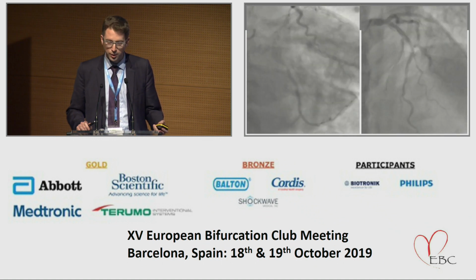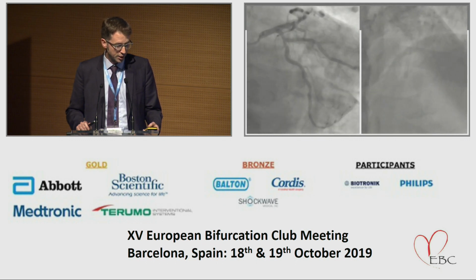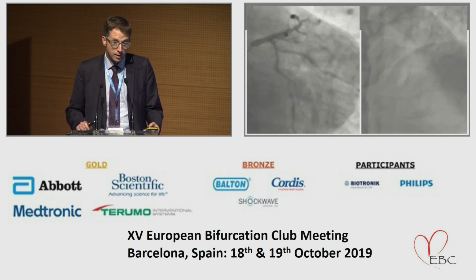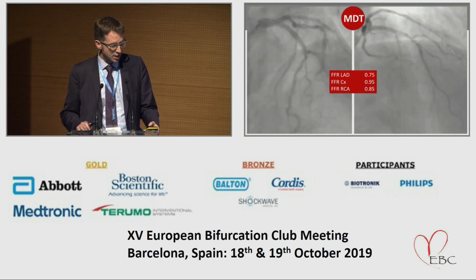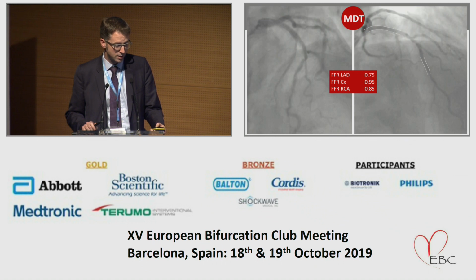So I'll show you an angiogram. It's not that complex, but the situation is. So we see in a caudal and in a cranial projection calcification plus stents and a bifurcation lesion in the LAD associated with a fairly large diagonal branch. So this is an interactive session, so I thought I would leave it just with the awareness of where the original stent is: we have a left main Liberté bare metal stent, followed by a Cipher, followed by a Taxus into the mid-LAD. Thierry, what to do now?